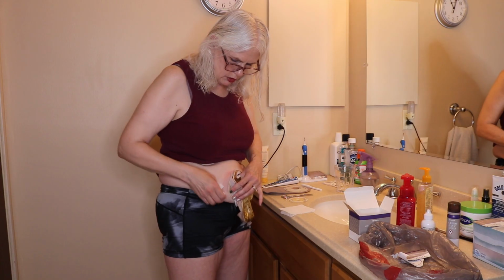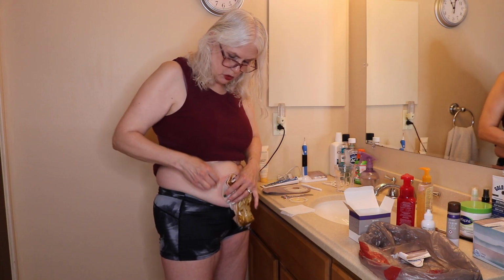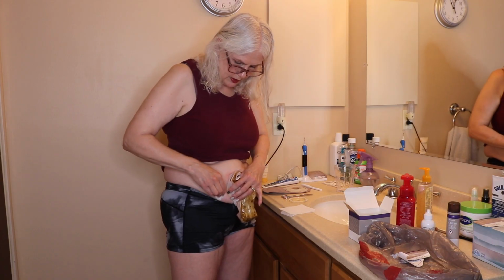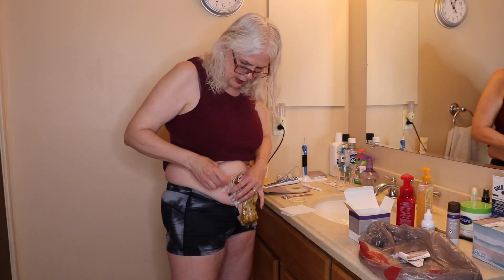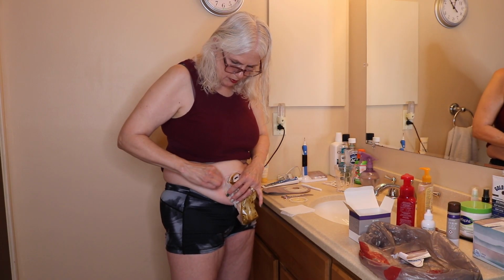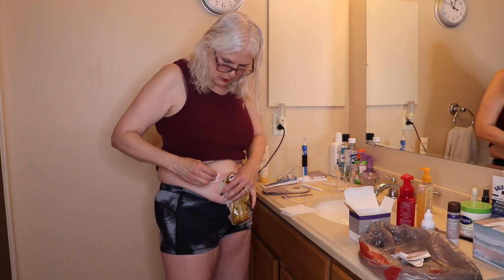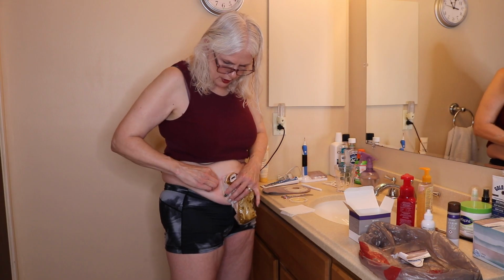If again the stoma wants to go, you have no control over your ostomy. When it wants to go, it goes. And so again, this way, if I have a bag on, it will end up in the bag. And I don't have to worry about going on the floor or anything.